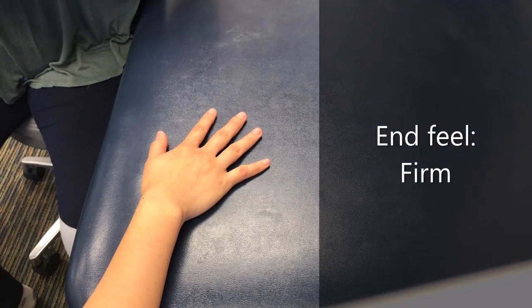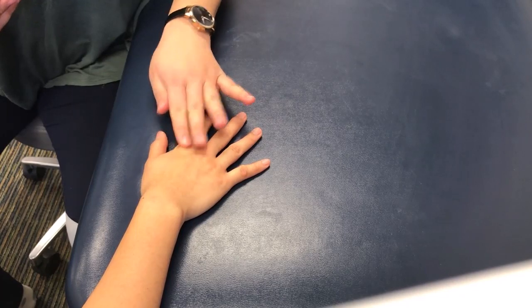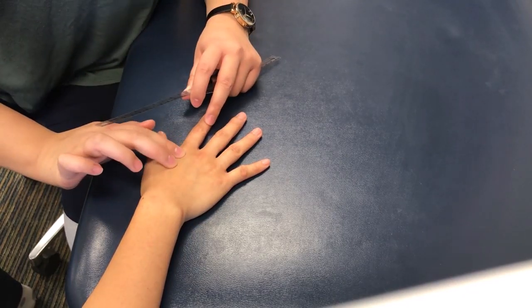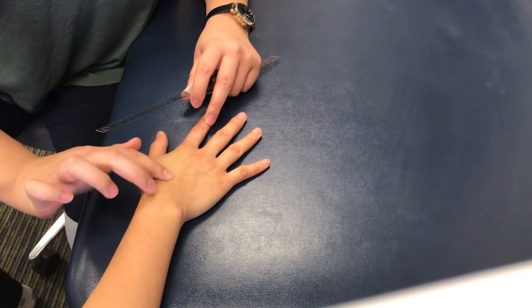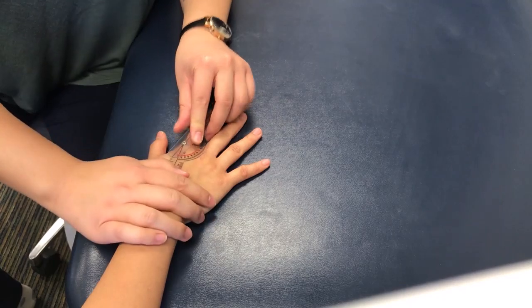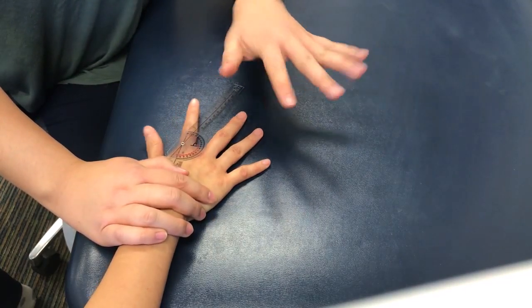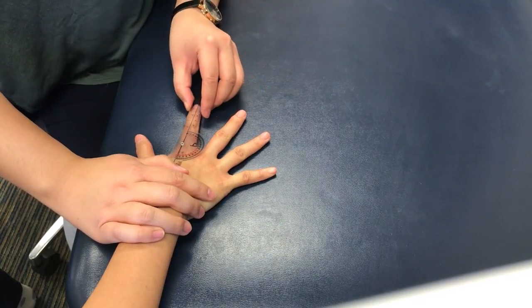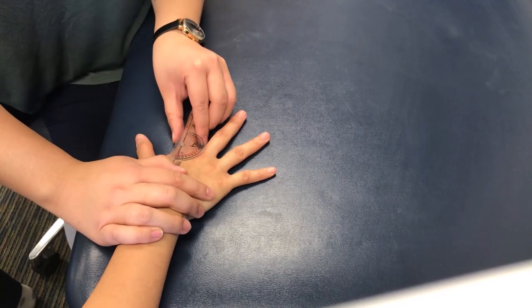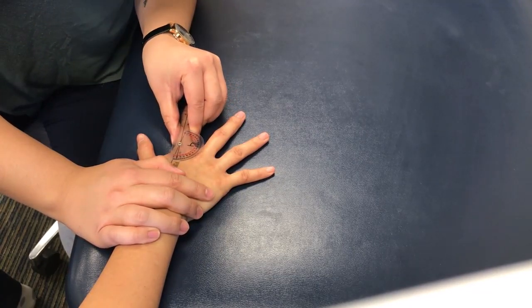So for MCP finger abduction, the axis will go on the dorsal side of the MCP joint, and the proximal arm will go along the metacarpal, which you will palpate. And then the distal arm is going to follow the proximal phalanx. So go ahead and spread your fingers. Active range of motion, I got 5, and then for passive range, I'll bring you into end range, which is 10.